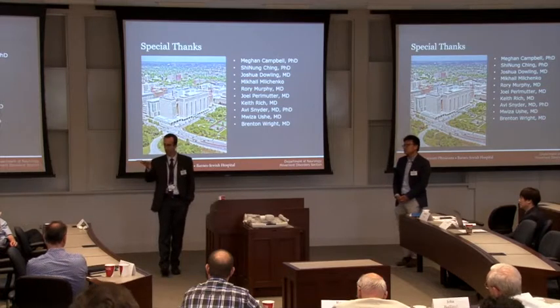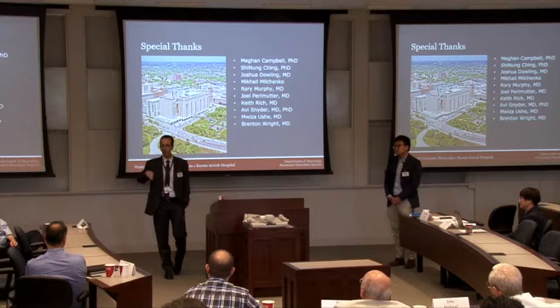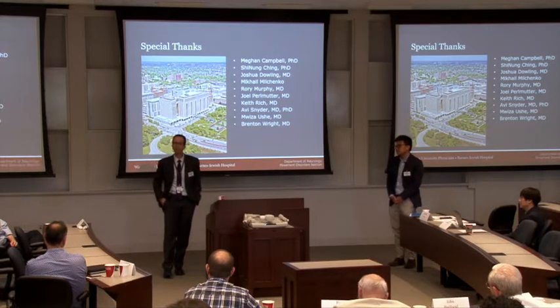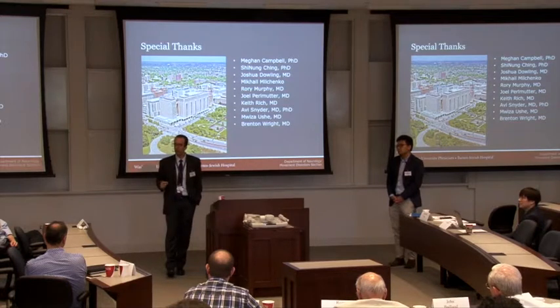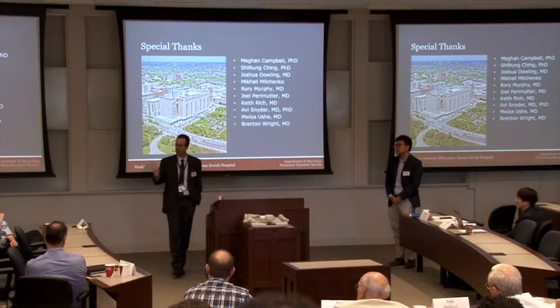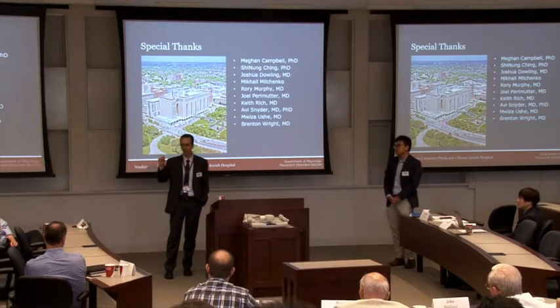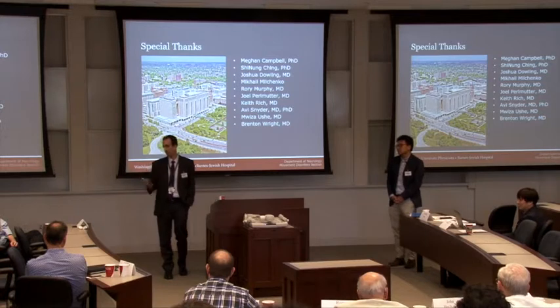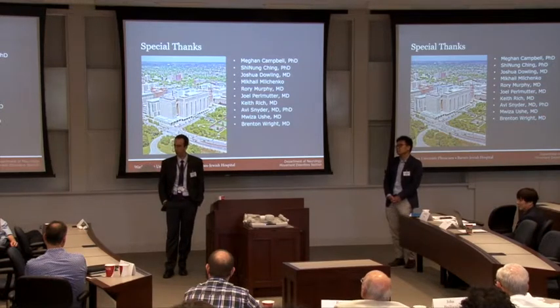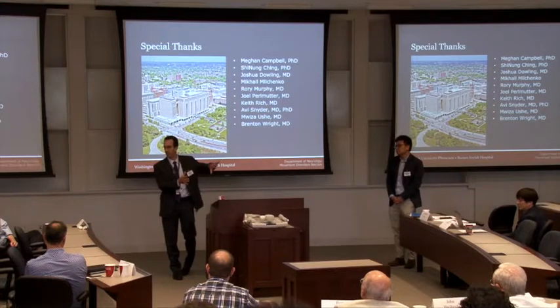The second part of that question was, what is the immediate effect versus the delayed effect? Certainly we see the tremor melt away just like that. We turn on the device, gone. The rigidity, the stiffness in the muscle, turn on the device, gone. Bradykinesia, the slowness of movement, we measure it like this, and if somebody's slower, that seems to respond in a more delayed fashion. At least in the maximal responses, it's on the order of 40 minutes. Now, that's Parkinson's disease.